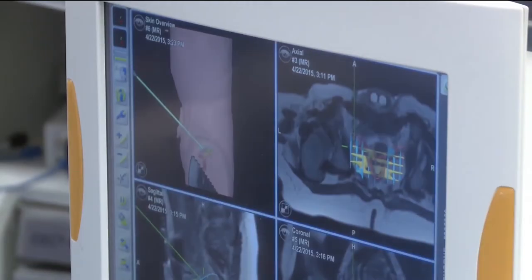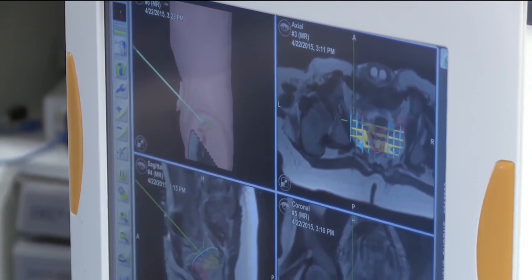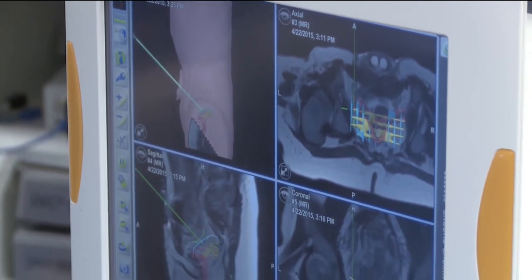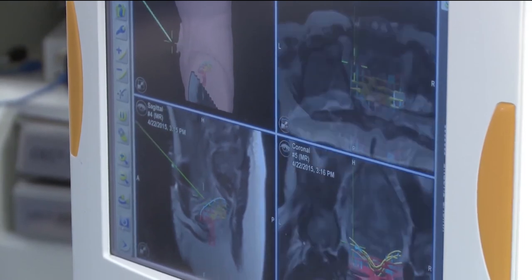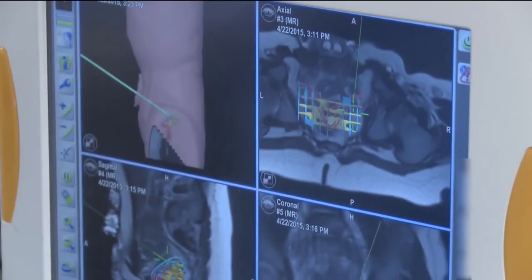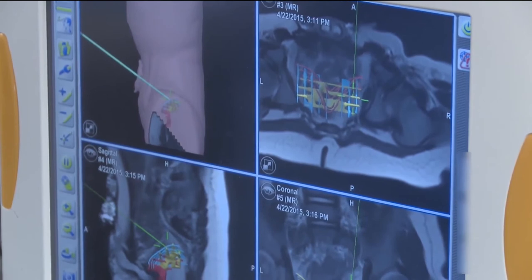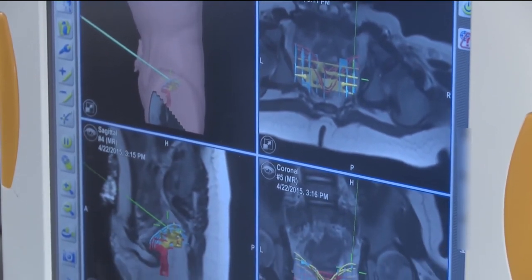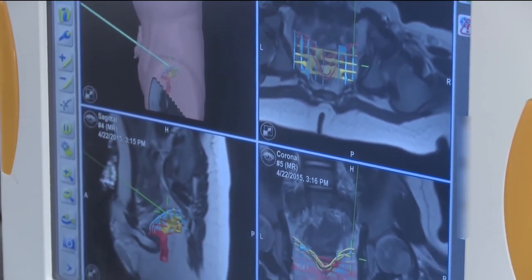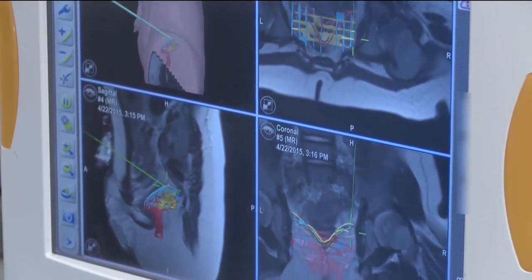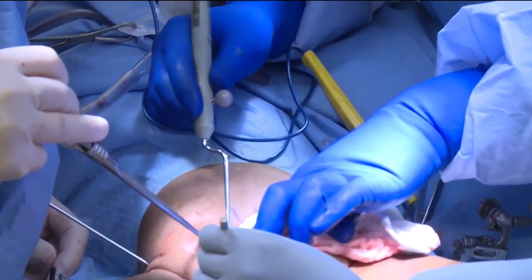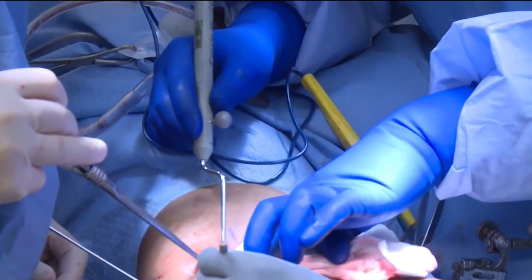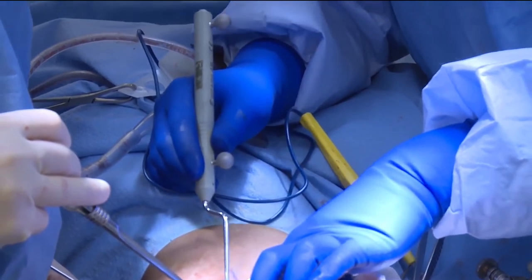The position of the tip of the stylet correlates with the MRI images on the screen of the BrainLab computer. We see here the pelvic floor muscular anatomy outlined in color. There are axial, sagittal, and coronal images as well as 3D reconstructive images.